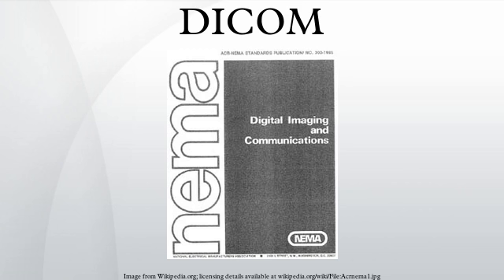Derivations: there are some derivations from the DICOM standard into other application areas. These include DICONDE, Digital Imaging and Communication in Non-Destructive Evaluation, which was established in 2004 as a way for non-destructive testing manufacturers and users to share image data.